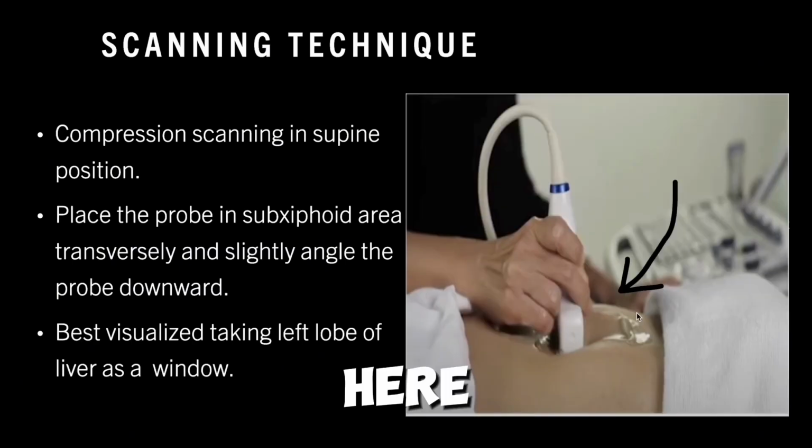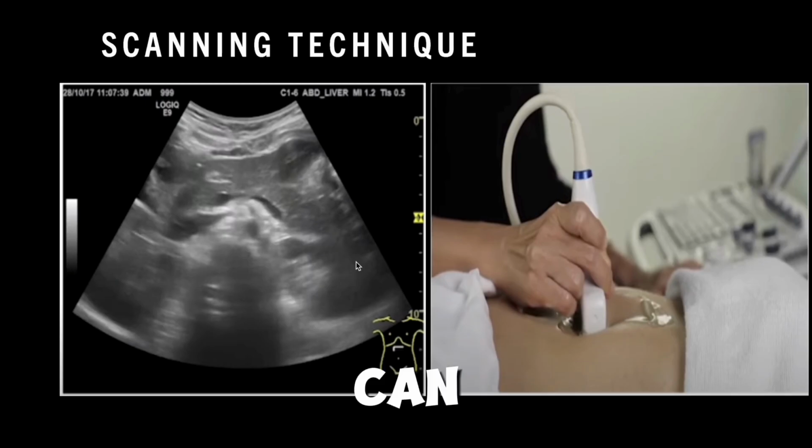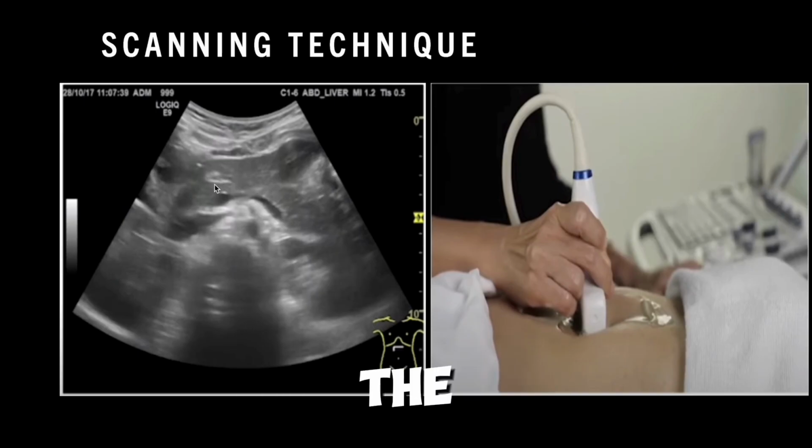Here the patient is lying in a supine position. Here is the xiphoid process. We should keep the probe just below the xiphoid process and slightly angle the probe downward. Then we can see this type of structure. This homogeneous structure is the pancreas.